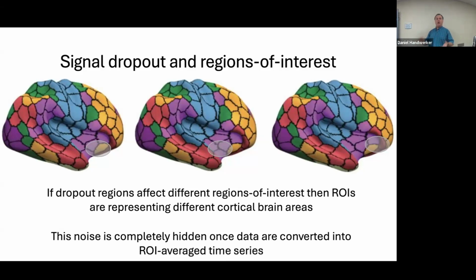So I think there are ways to use bootstrapping to assess the extent of the problem, and that will help you with interpretation. But bootstrapping is a tool for interpretation. You can use it to say, how is this affecting my results? And it could be that you do it and find it's not affecting my results, but I would frame it in that way.